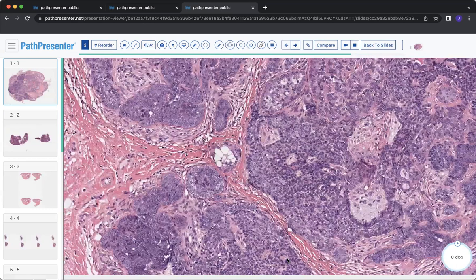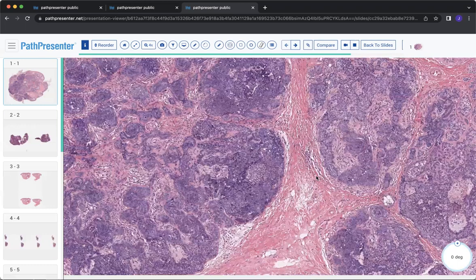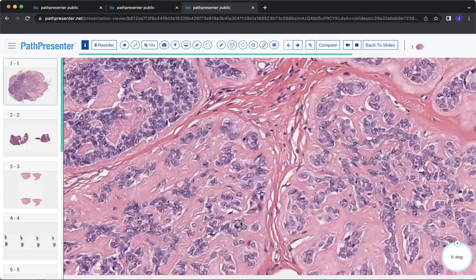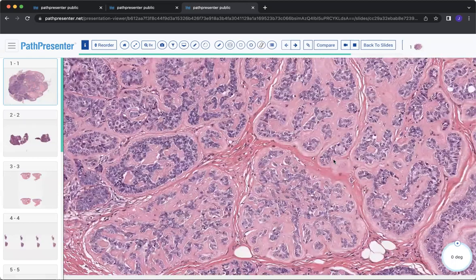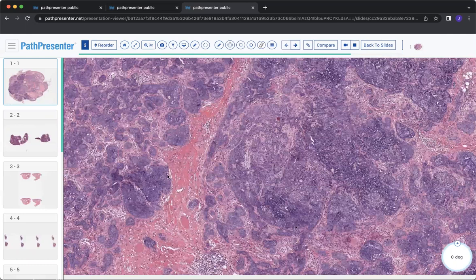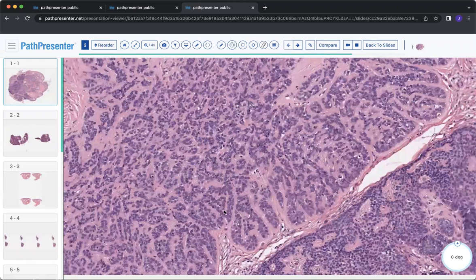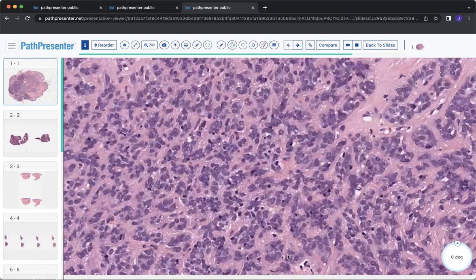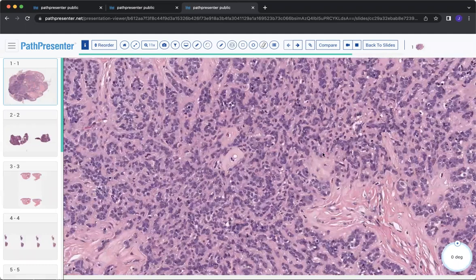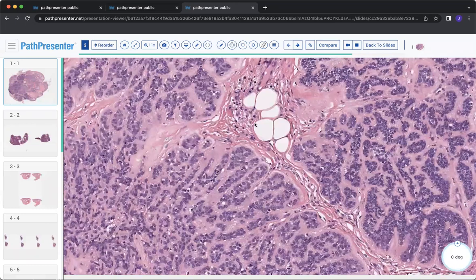You can find different patterns within a trichoblastoma. So you can see on moderate power, there's a more dense population of cells. Over here, you have the cells more spread out with more of a fibrous stroma directly surrounding it. So just to give you a sense, in this large trichoblastoma, there can be different architectures, different cellular morphologies. Again, here you have this more reticulated pattern. And you can think about if a basal cell takes on a malignant form or develops an abnormal cell, then it can take on different patterns as well.